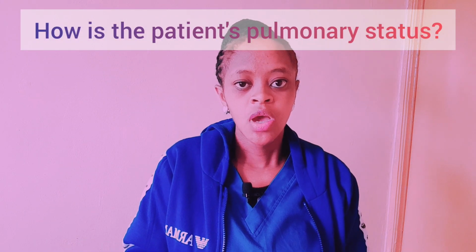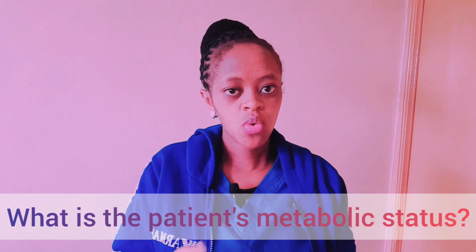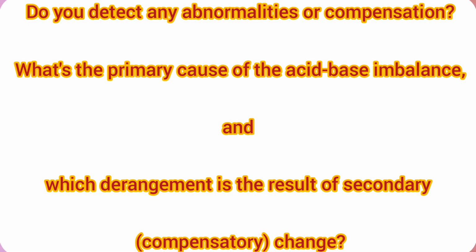Third, how is the patient's pulmonary status? Look at the partial pressure of the carbon dioxide. Number 4, what is the patient's metabolic status? Review the bicarbonate levels. And number 5, do you detect any abnormalities or compensation?